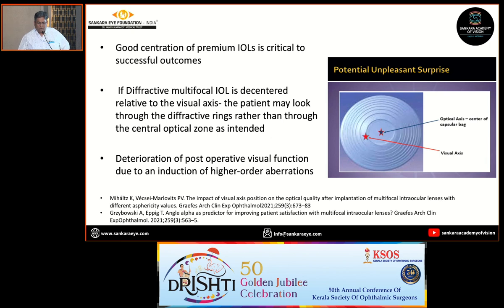Now, good centration of premium IOLs is critical for successful outcomes. If a diffractive IOL is decentered in relation to the visual axis, the patient may look through the diffractive rings and not through the central optical zone, thereby deteriorating the post-op visual function and increasing the higher-order aberrations.